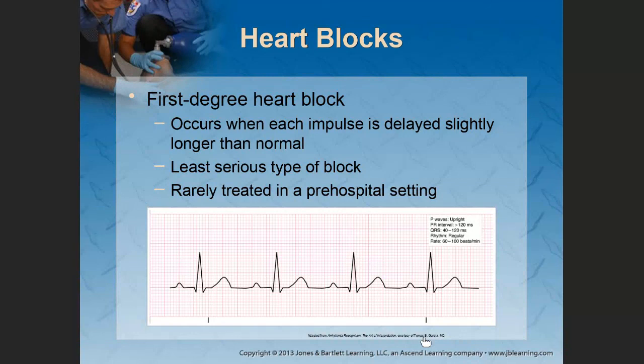So I'll have a worksheet for your ECG stuff, and your goal is going to be to write what the rhythm is, right? So you'll see the waveform, you write if it's a sinus rhythm, sinus tach, sinus bradycardia, ventricular tachycardia, ventricular fibrillation, PEA, asystole, depending on which rhythms I give you. Right, so that's it for your basics for the ECG. I don't think there is anything else I would need to cover from this for this section. So I think that's it. I think we covered everything.